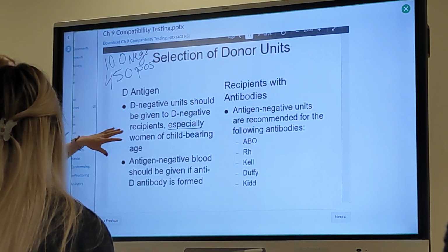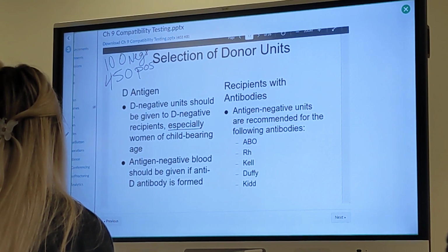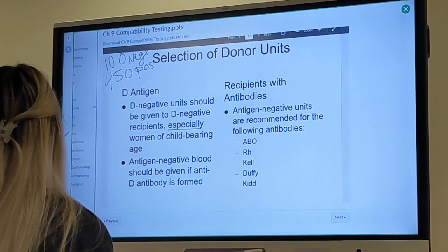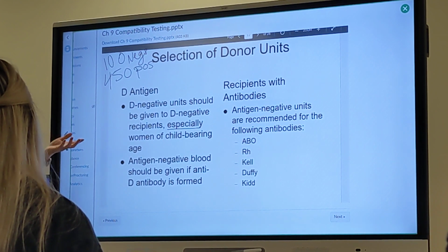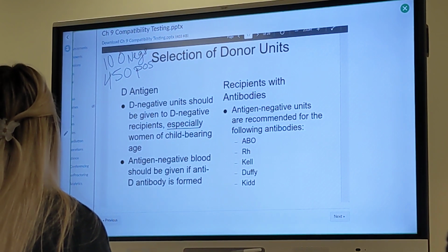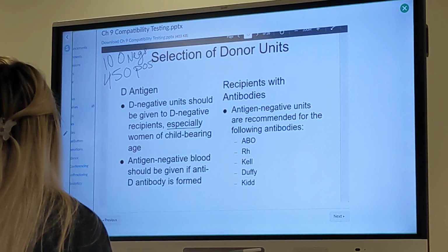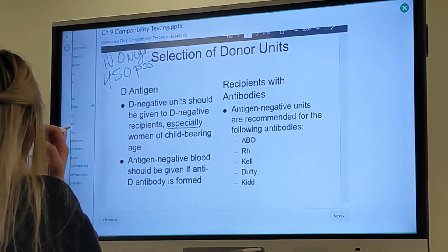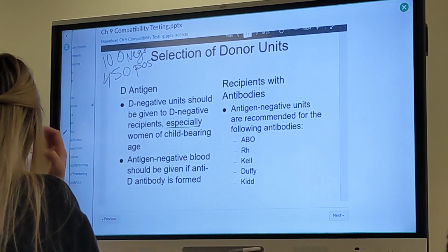If childbearing age is the most important, you have to prove it, and you have to talk to the pathologist, the transfusion services medical director, is what we had. I would walk to her office and say, so-and-so's in surgery, they're having a hysterectomy right now, I confirmed with the doctor. Can I switch her? I only have 7 O-negs on the shelf. That's the kind of decisions you have to make in blood bank. It's not always the case, but for some reason during the summertime and around the holidays, the blood supply gets pretty slim. I have seen it happen, and in COVID it got bad too.